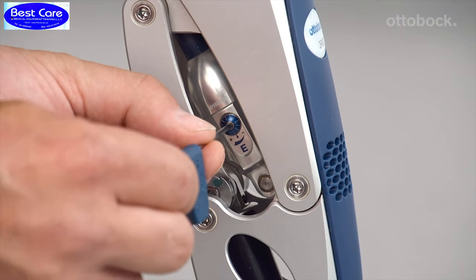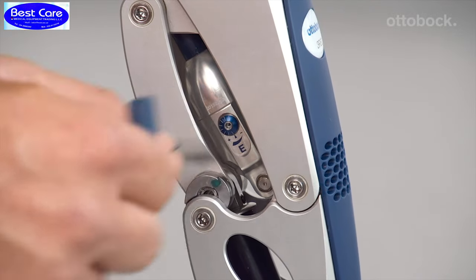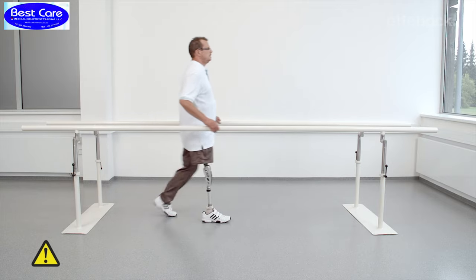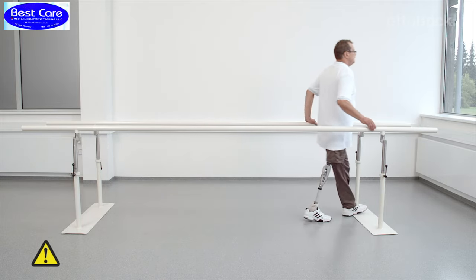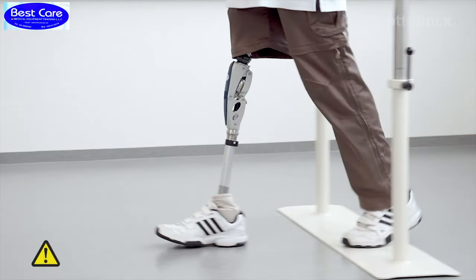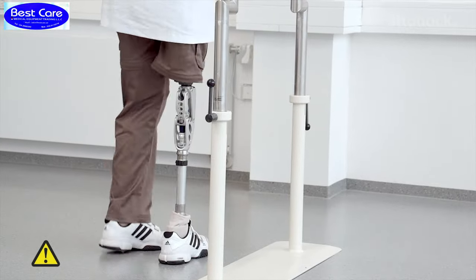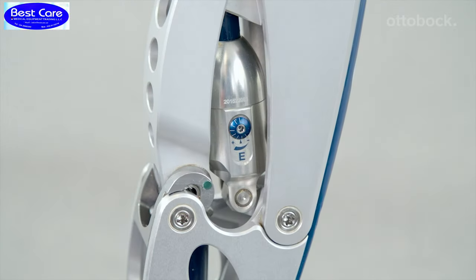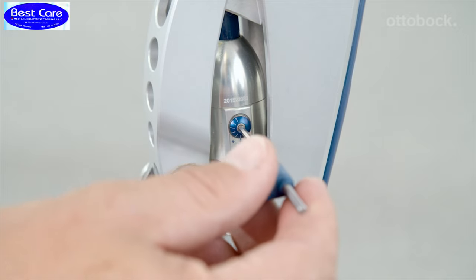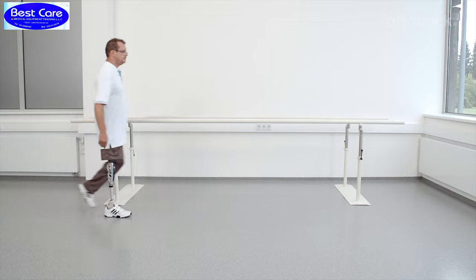The extension damping is shown at its maximum. As shown here, an extension damping set too high means that the knee joint no longer comes into full extension, which could lead to a fall. Therefore, please decrease the extension damping slightly to make sure that the prosthetic knee is in full extension when the prosthesis is loaded during heel strike.